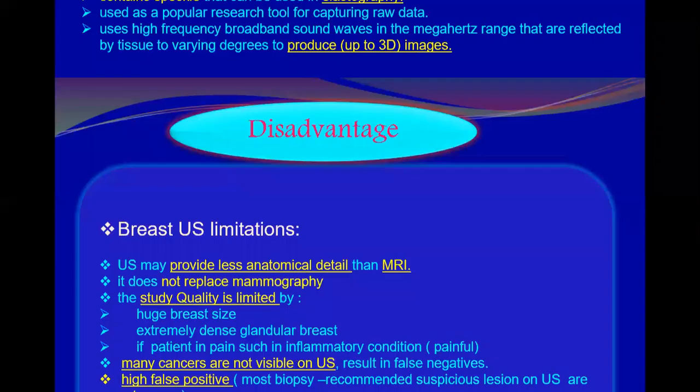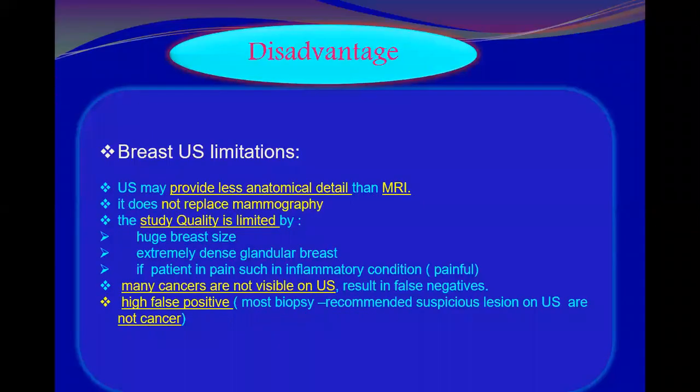What are the disadvantages of ultrasound? Operator dependent, it depends on the skill of the operator. Excellent, you mentioned the most important. So for breast ultrasound, we can mention the limitations first, then go for the most important disadvantages.